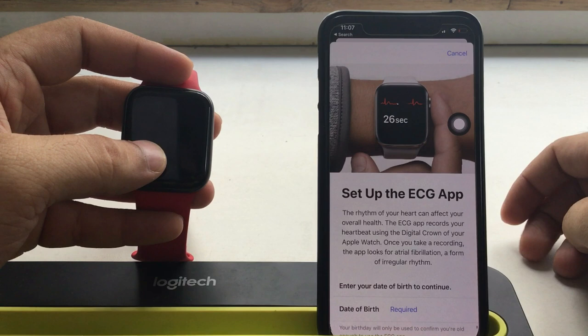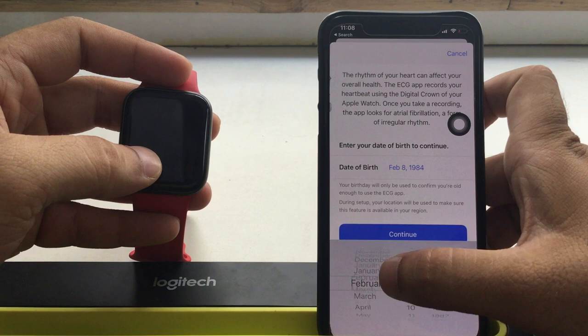The next screen will ask you to enter your birth date. Enter the month, date, and year. Now tap on the continue button. Scroll down and tap continue.